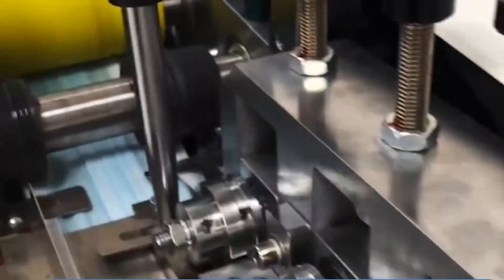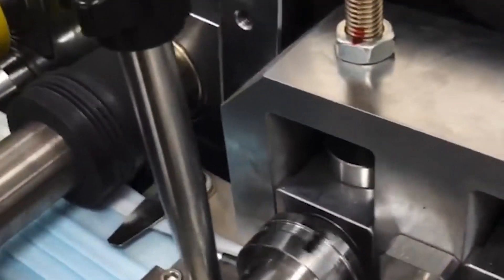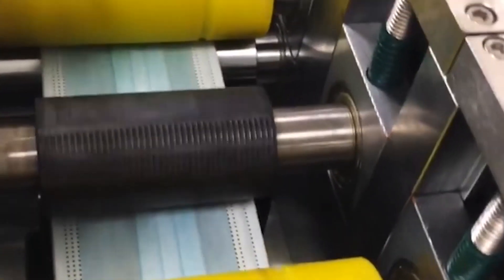The right side of the fabric is connected to the fabric roll. As mentioned above, the fabric roll placement frame is driven. The function of this tensioning mechanism is to prevent the fabric from being too loose or too tight.